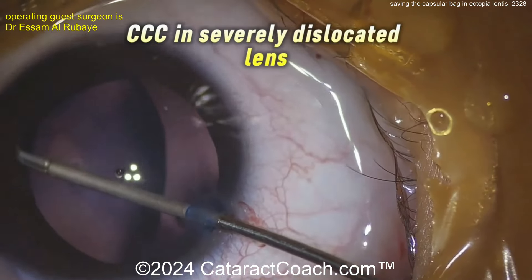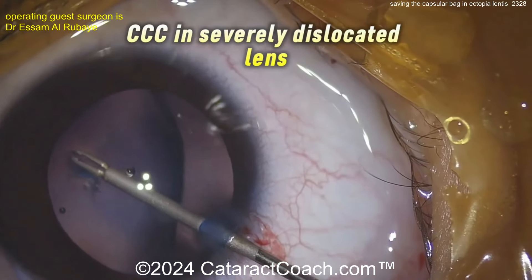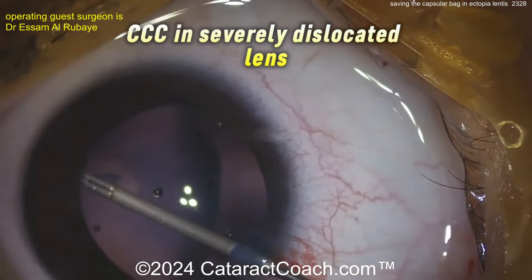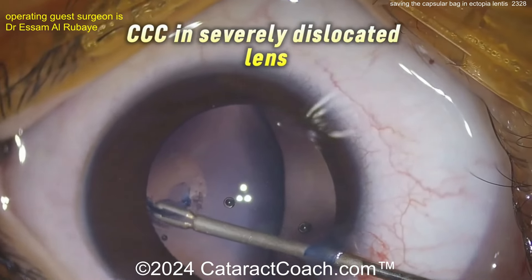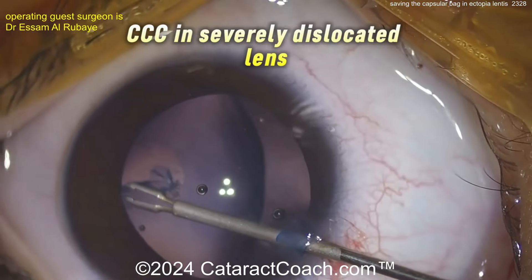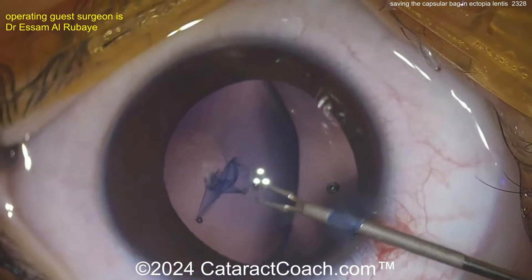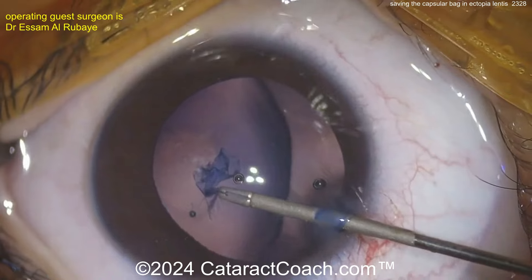It's not strong, it's not taut, and as a result it's hard to create this capsulorrhexis. Notice how the surgeon is very smart in creating a capsulorrhexis centered on the lens, even though you can't see the whole lens. That's why the rhexis looks like it does here — you want to get this rhexis centered on the lens itself. You can use hooks here to help bring that lens back centrally, but this patient has a lot of zonular laxity and loss, causing severe subluxation of this crystalline lens.